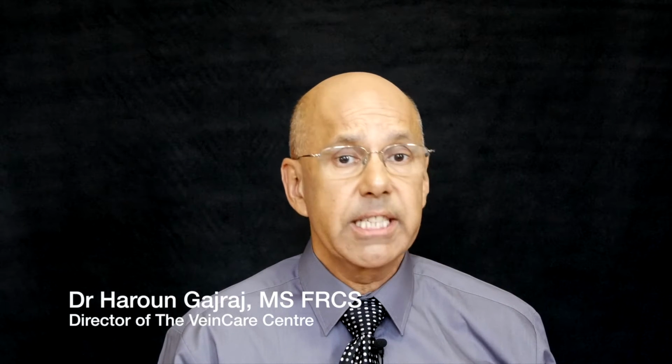Getting good images of the vessels and accurately diagnosing disturbances of blood flow in the veins depends on setting up the ultrasound equipment correctly. In this episode, Michelle Moore discusses ultrasound transducer frequency and its relation to penetration and resolution for image optimization, and she discusses pulse wave settings for detecting blood flow.